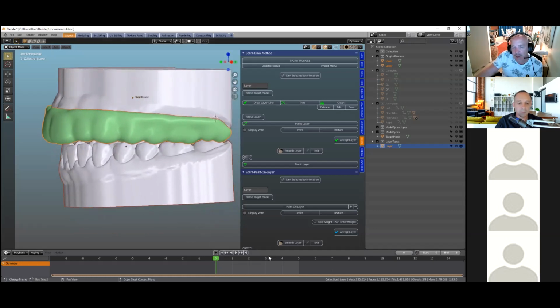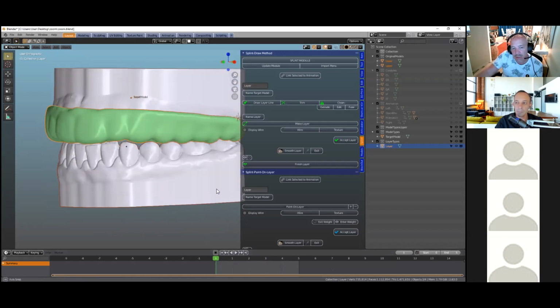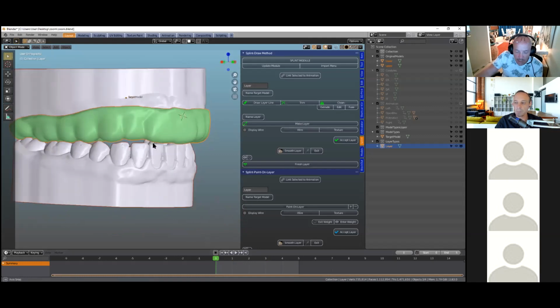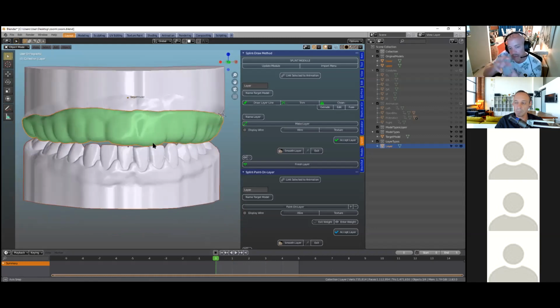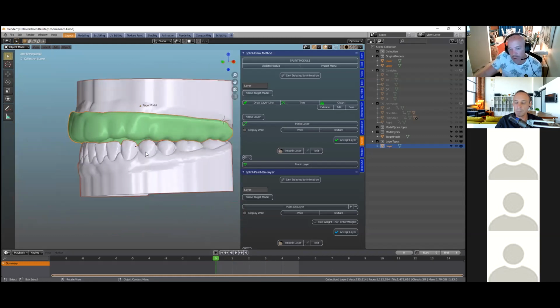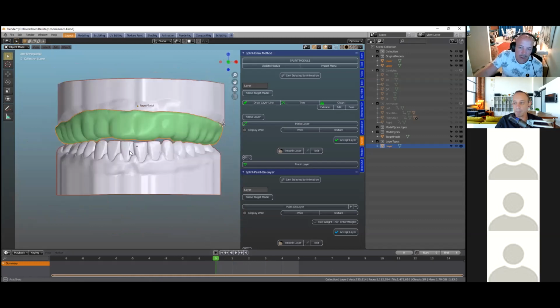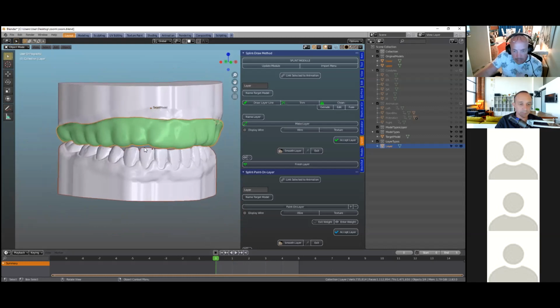Now I don't know how good that is for the TMJ joint, and I would think it's not a good idea doing that, because ideally we need support all the way through on the lower as well, so that we can equally distribute the forces of occlusion. Isn't that the whole point of having a splint in the first place? So all right, we need to build up this layer.